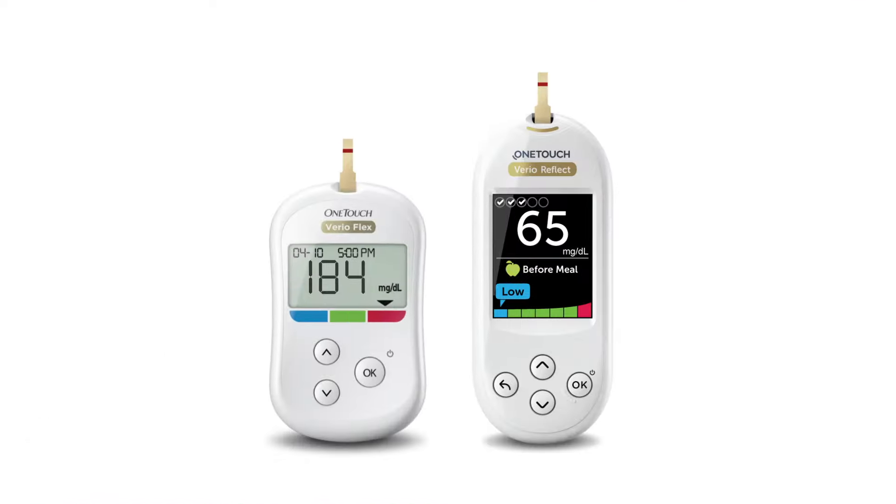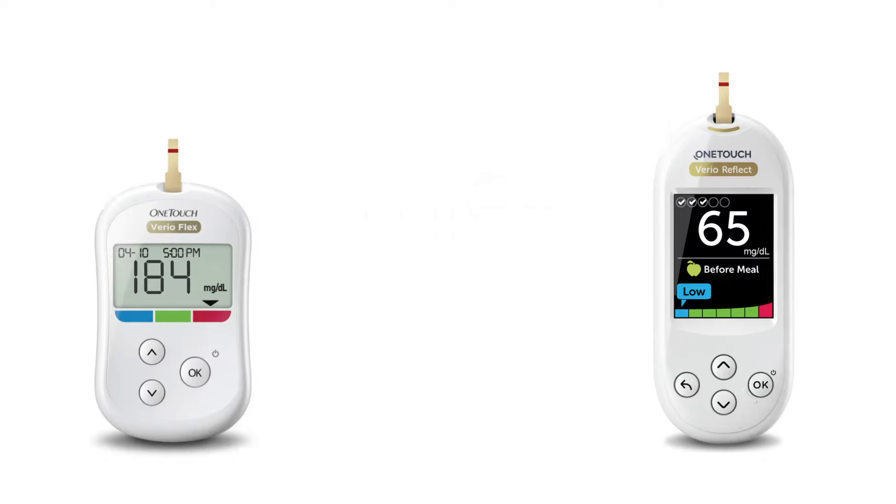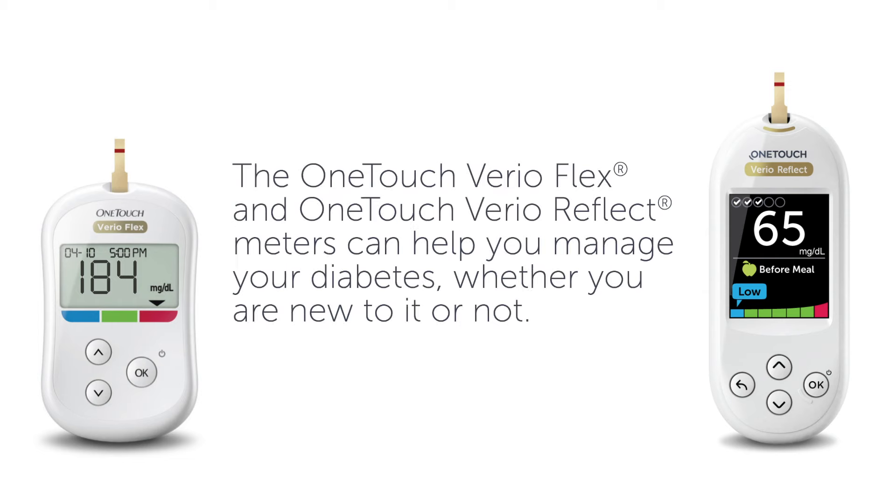Selecting the right meter is important. We will show you two meters that can help you manage your blood sugar: the OneTouch VarioFlex and OneTouch VarioReflect meters can help you manage your diabetes, whether you are new to it or not.